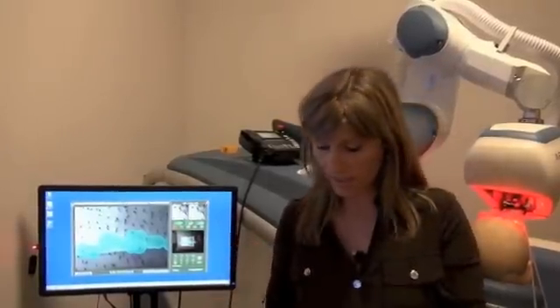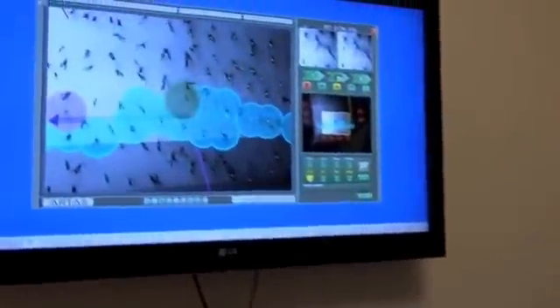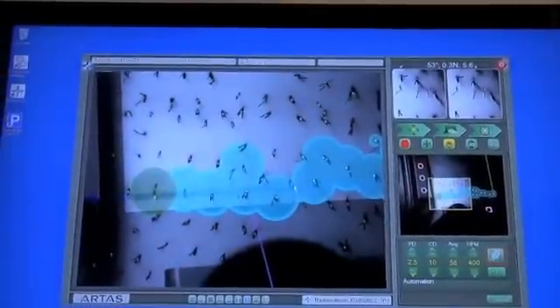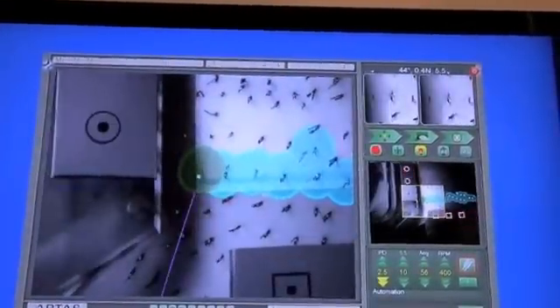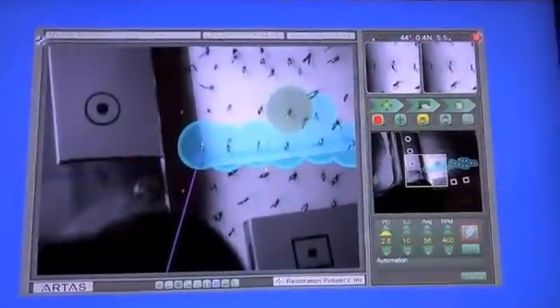If you want to see it again, it's really fascinating how the system looks at the hair. I can even decide to skip certain hairs, but mostly the system will look at the hair. That's a green circle. Once we start dissecting, the moment you start dissecting, it turns blue. It says it's done, it's past.